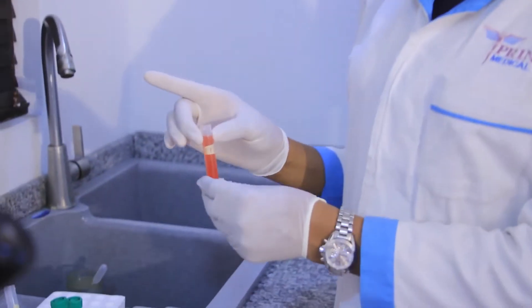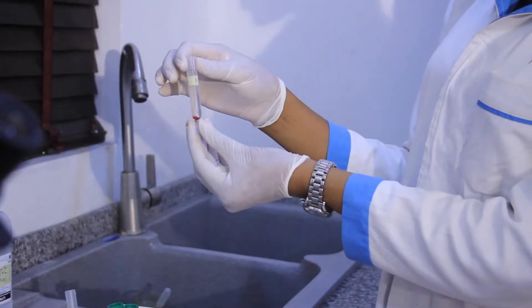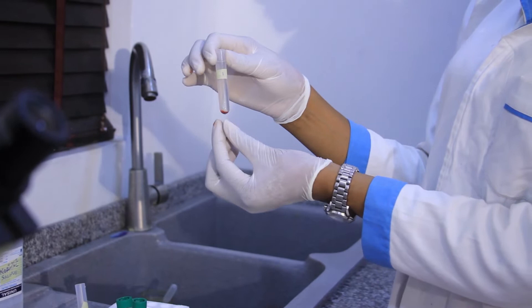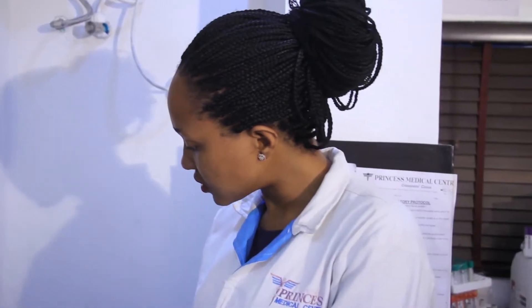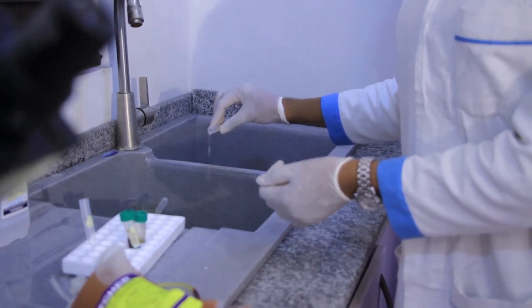We're going to put this into our centrifuge and set it at 3500 RPM for 3 minutes. We'll wash it 3 times. After 3 minutes, this is how it looks. The packed red blood cells are found underneath, while this is the normal saline. So we'll dispense — not completely — we'll dispense a little.